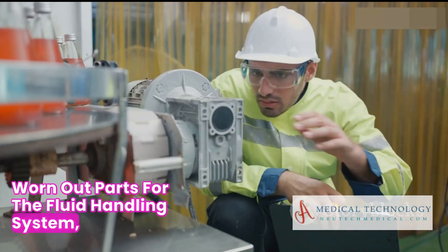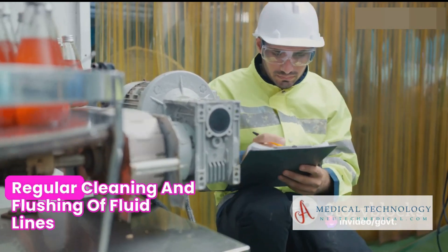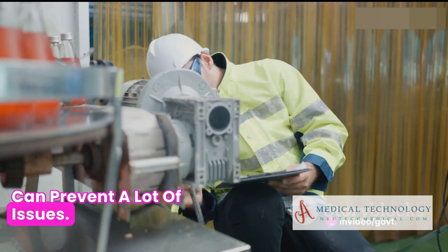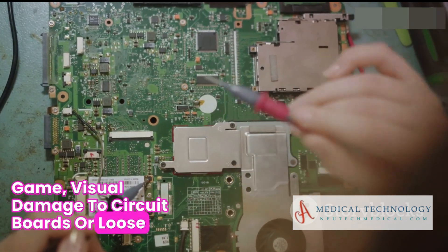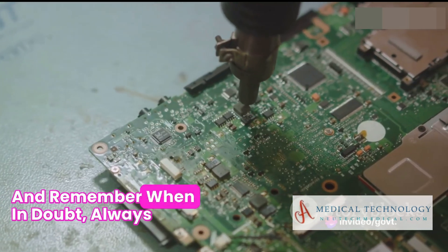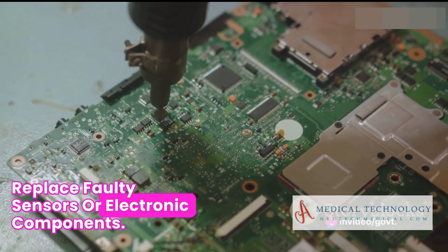For the fluid handling system, watch out for leaks in tubing and connections. Regular cleaning and flushing of fluid lines can prevent a lot of issues. Electronics and sensors are a whole different ballgame. Visual damage to circuit boards or loose sensor connections can lead to major problems. And remember, when in doubt, always replace faulty sensors or electronic components.